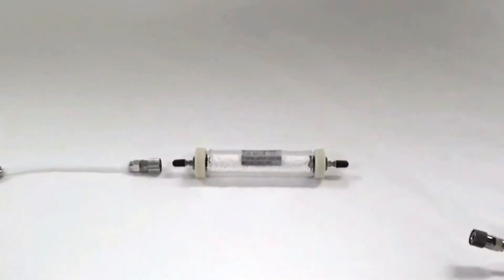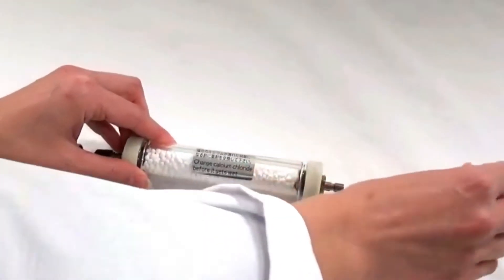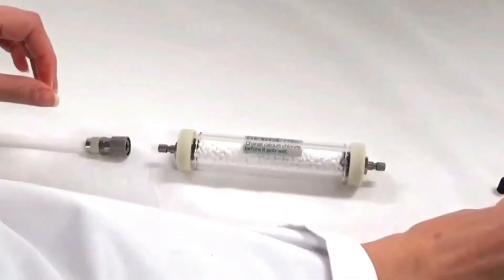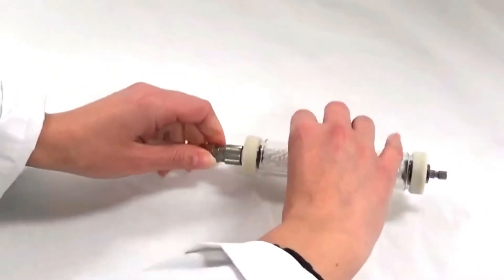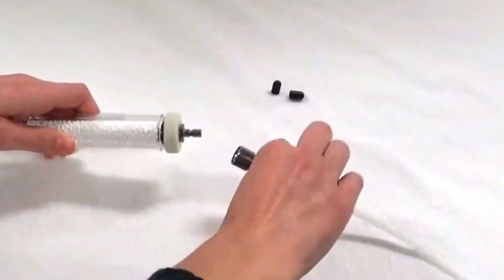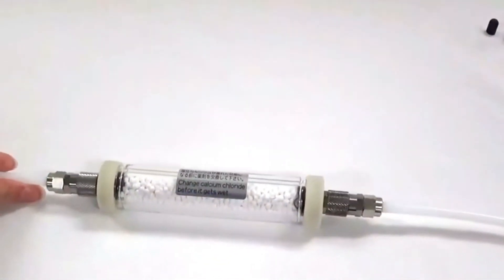Next, we will remove the black protective caps from the calcium chloride filter and attach the 6-inch Teflon tube to one side. Make sure it locks, and attach the 3-foot Teflon tube to the other side, also making sure that it locks into place with the quick connects.